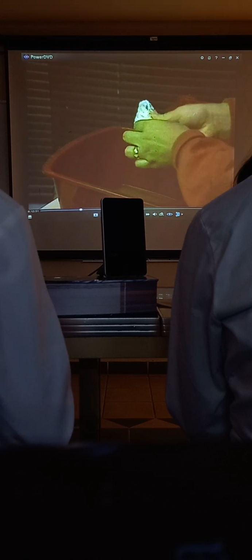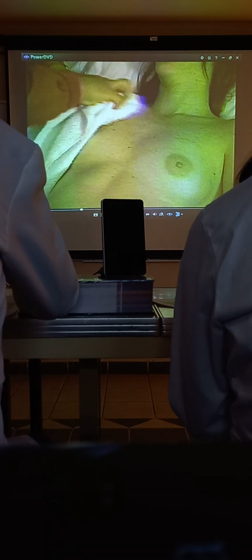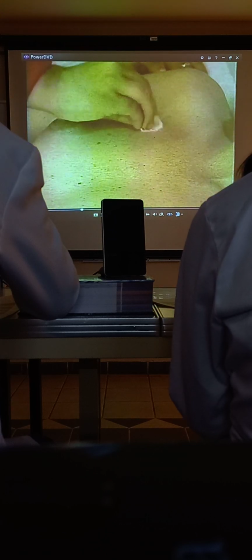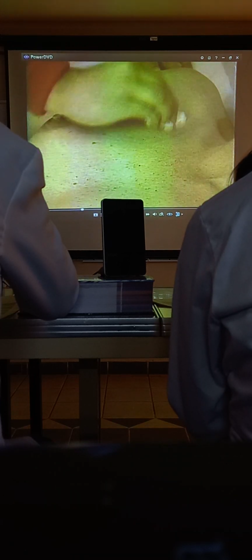Use soap and water to wash each site. You may need to clip excess chest hair or shave a 10-centimeter circle to improve electrode adherence. Try to avoid shaving if possible, however. Use a towel to dry the skin thoroughly. Then remove excess skin oils with an alcohol prep. Use a brisk rubbing action to create friction. Omit this step for an elderly person or a patient with fragile skin. After the alcohol has evaporated, use dry gauze to slightly roughen the skin. Some disposable electrodes have a spot on the cover that can be used to roughen the skin.